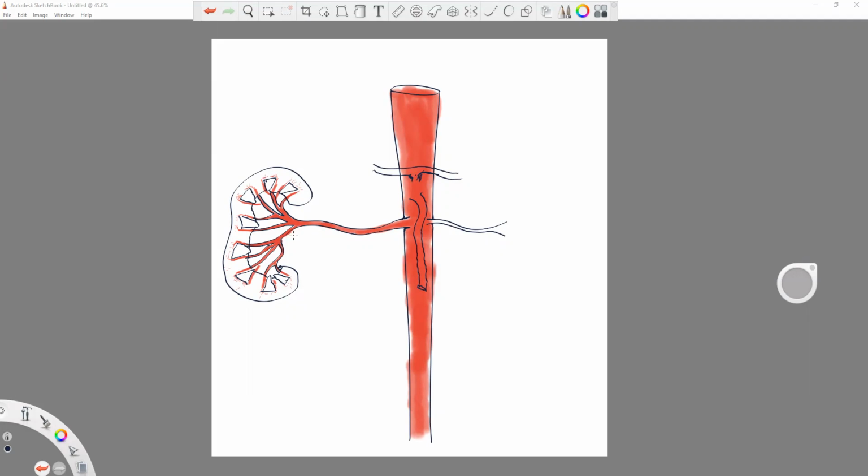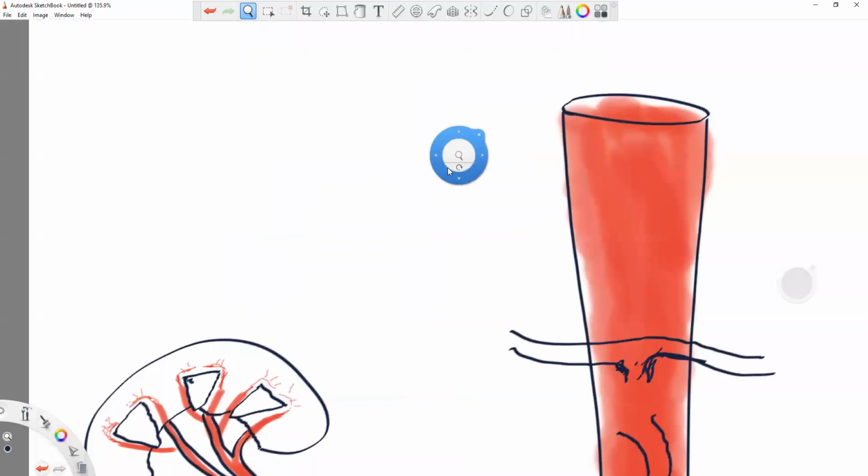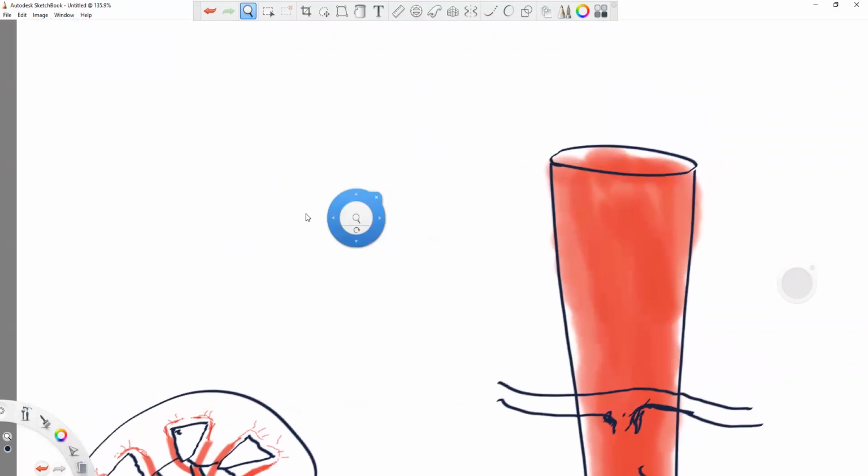And then you officially have a Doppler study. You definitely always want to make sure that you get the vein, not only color Doppler, but spectral Doppler. Once you do that, it is officially a Doppler exam, and you can legally bill for it. If you don't do that, it's actually not a correct exam.